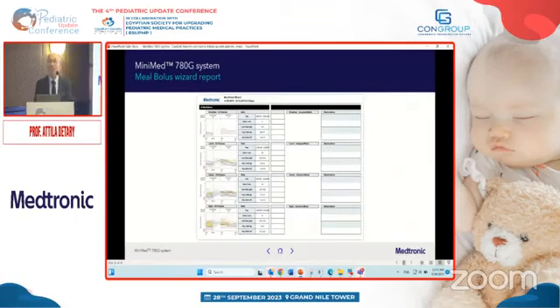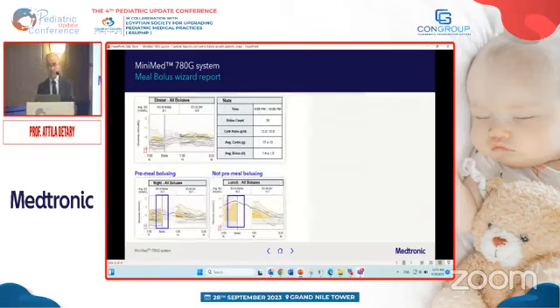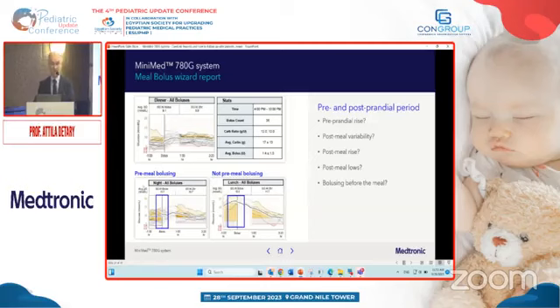Then we have a meal report. The meal report is good to see the meal periods before and after the meal. The only thing the patient has to do manually with this pump is to announce the meal. So before each meal, the patient should enter the carbohydrate grams. So I'm going to eat, and what is the expected amount of carbs I'm going to eat? It is good to do 10, 15 minutes before I start eating.